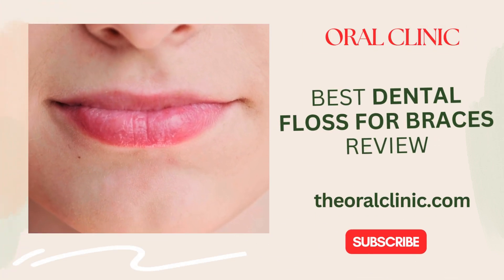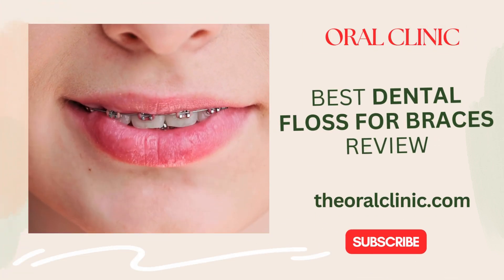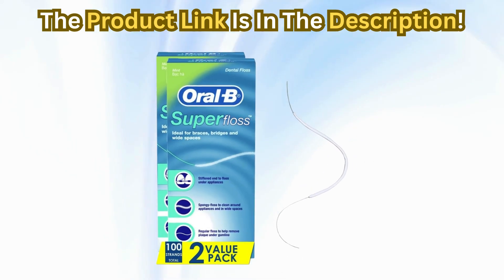Today, we're talking about something that's a game-changer for anyone with braces: the Oral-B Dental Floss for Braces, Super Floss Pre-Cut Strands, Mint, 50 Count, Pack of Two.